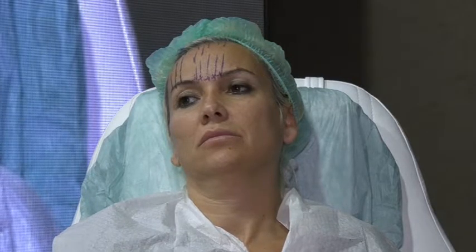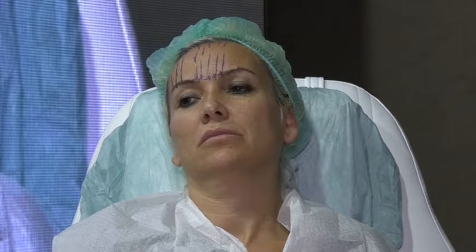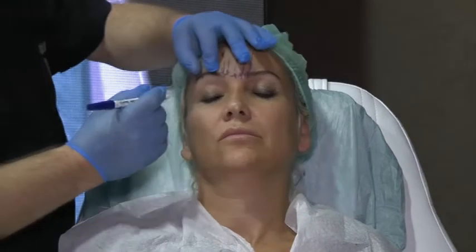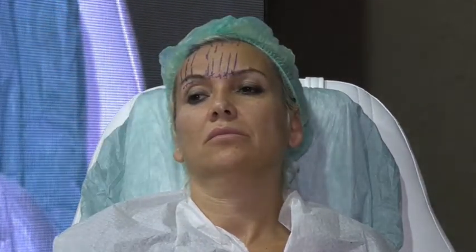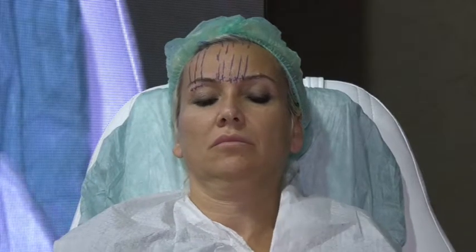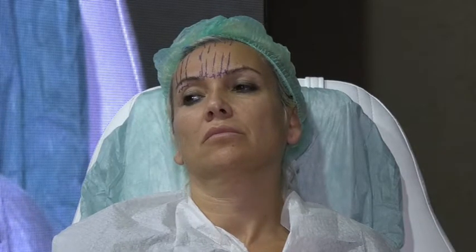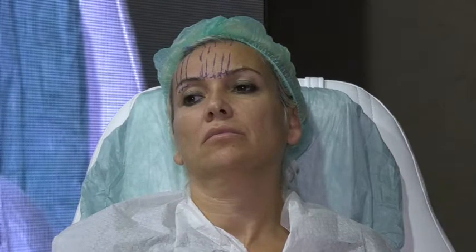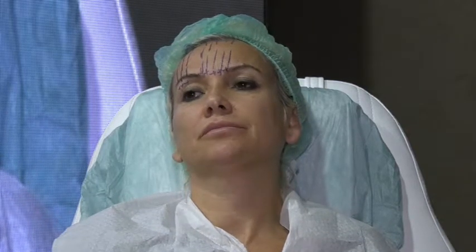Okay? So now we are almost done with the eyebrow. Nothing more to do. There is also a big crime people do. I see it sometimes in videos and live videos. They start the threads from here. Is this logical? Why people do it like that, I really don't understand. The threads have to start from the upper border of the eyebrow, not below the eyebrow. If you go below the eyebrow, you will take the eyebrow with this shape, with the same look like that, and you will not lift very well. So we always start from the upper border of the eyebrow, not from the lower border.